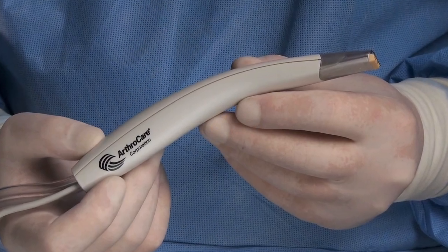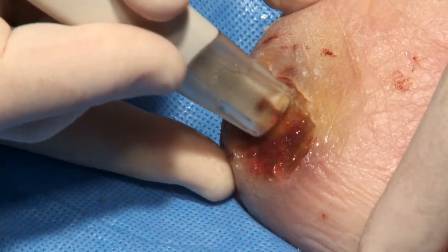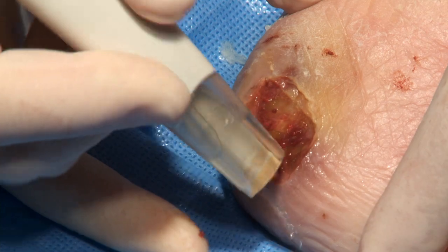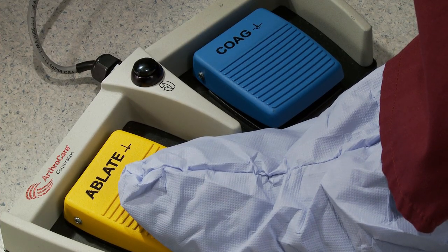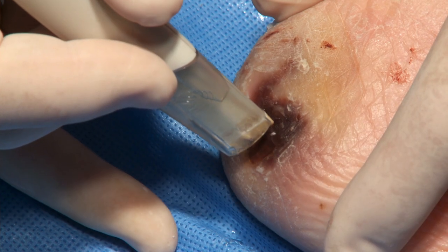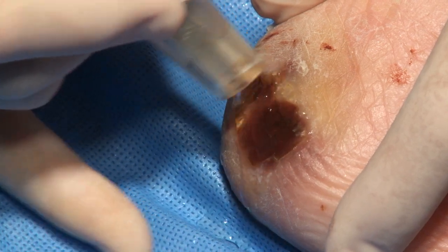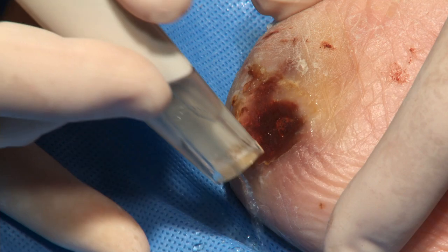The Wound Wand debridement device is now ready to use. Ablation, coagulation, and flow rate settings can be adjusted to surgeon preference. Depress the yellow ablate pedal on the foot control to activate the Wound Wand device. Place the device tip in contact with the target tissue and debride the wound distally to proximally at a rate of approximately 2 cm per second.